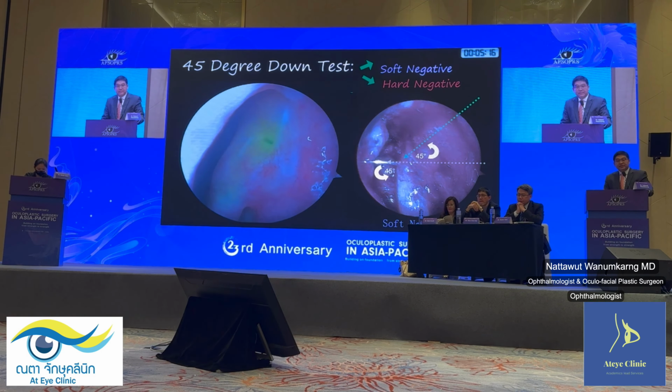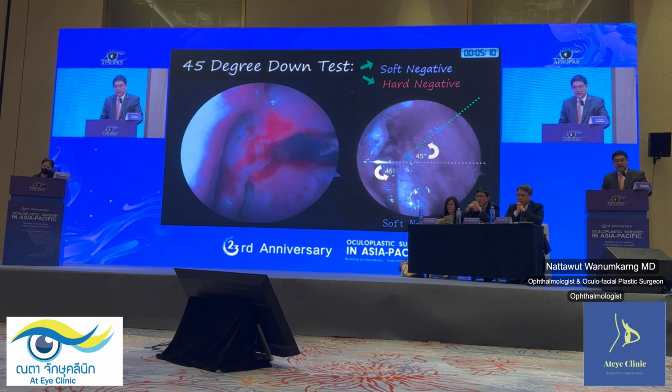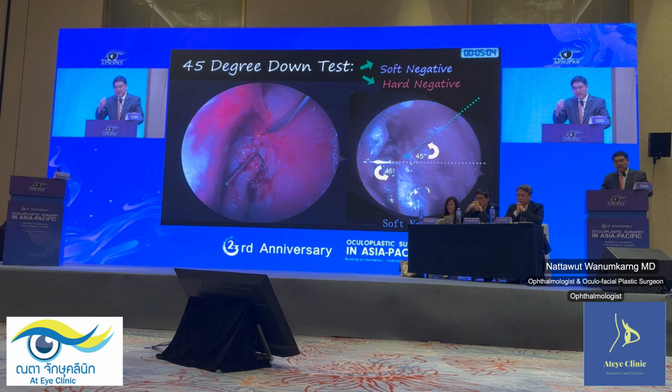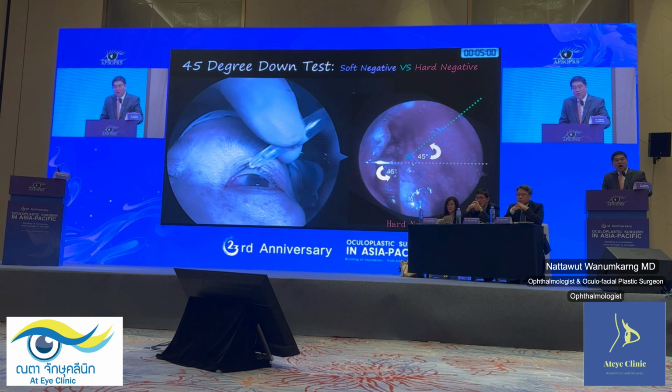So this is the soft negative. The soft negative means that when you put the tip of the Bowman probe down, you cannot pass freely through to the nasal cavity, so it stops. You can feel a soft resistance. That's called soft negative.